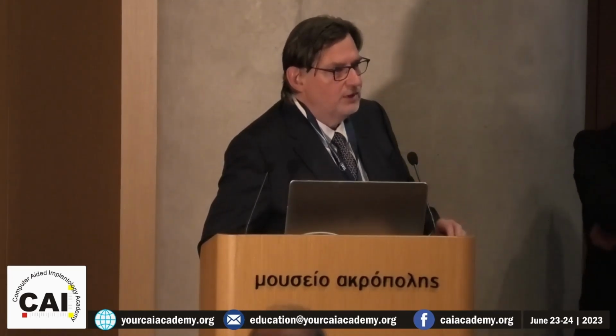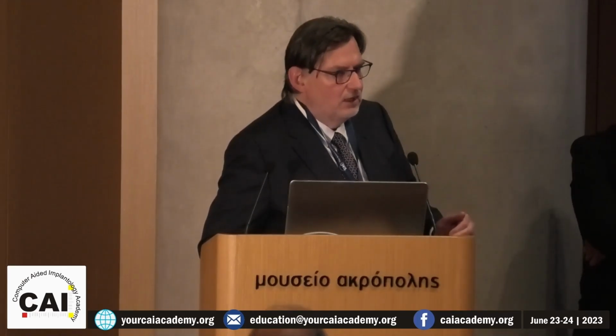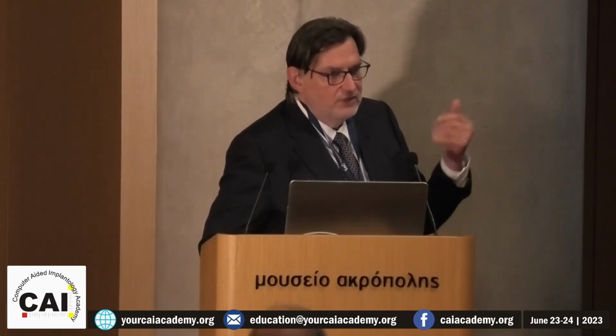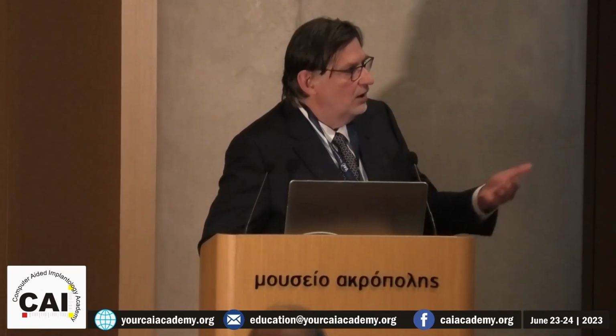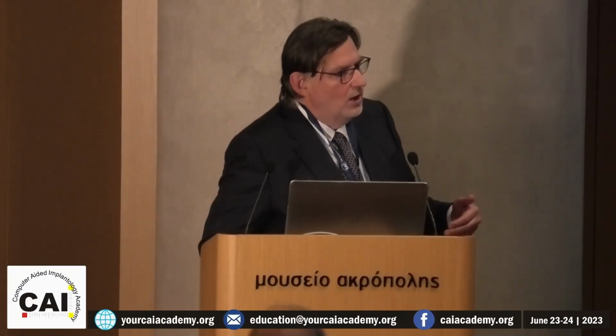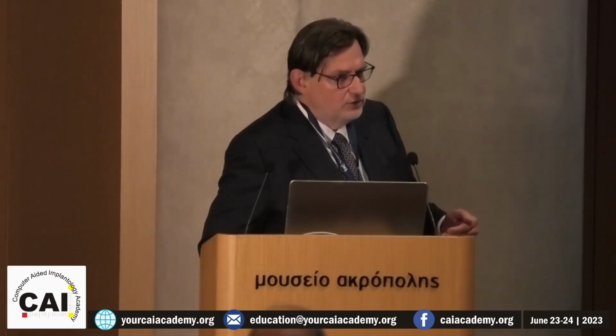She's very expert at that. She knows that very well. So she always verified, and she did it. And by the end, after 20 cases, we said it doesn't make sense, because the program does it in 5 seconds, and she has 15 minutes to do that because it has to do segmentation and so on. So in these aspects, artificial intelligence is useful.